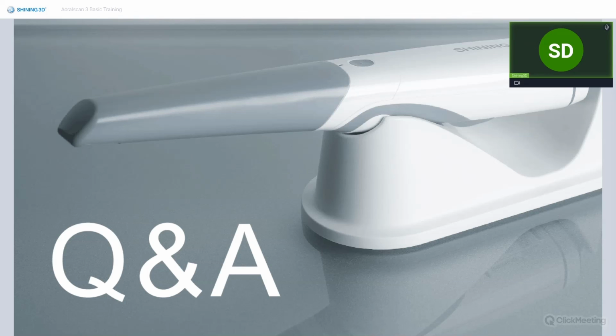In the presentation, you said the orthodontic teeth movement was just for reference, but if I want to make the whole process, can I trust it? I suggest not. If you are going to do a real orthodontics case, you need to use some professional designing software.